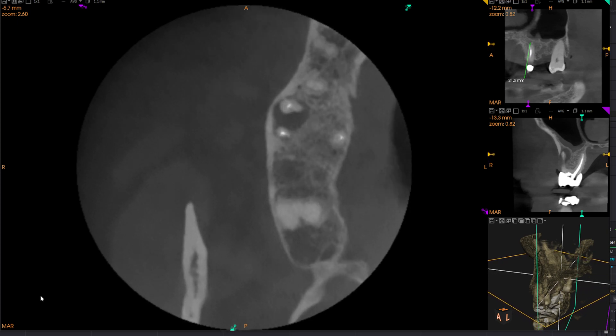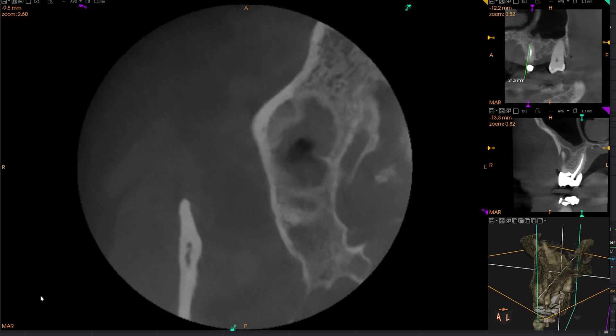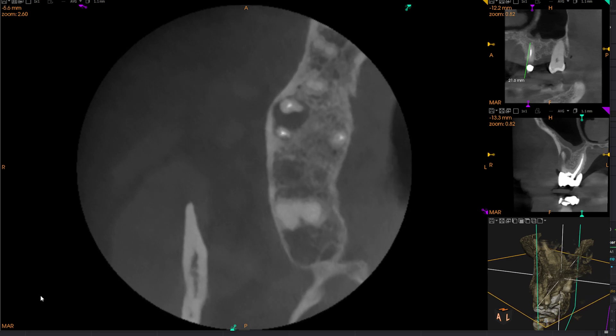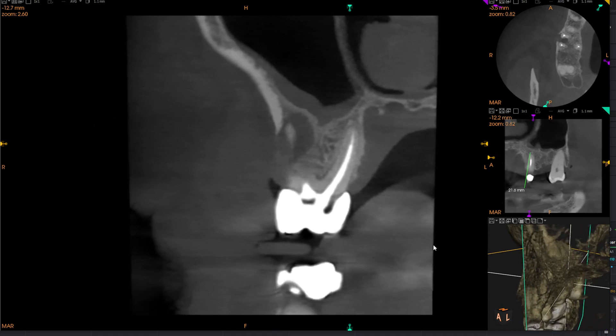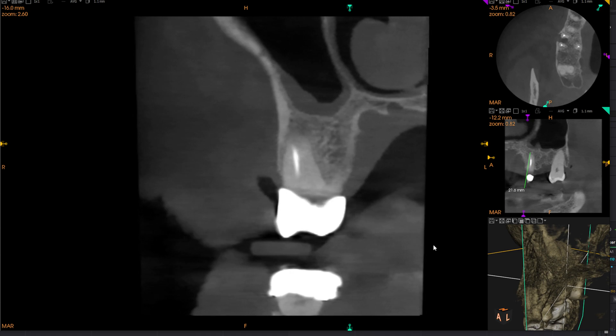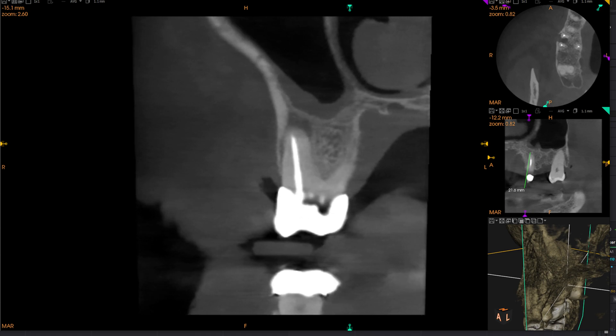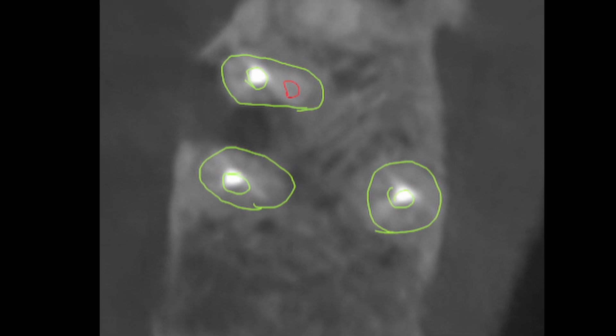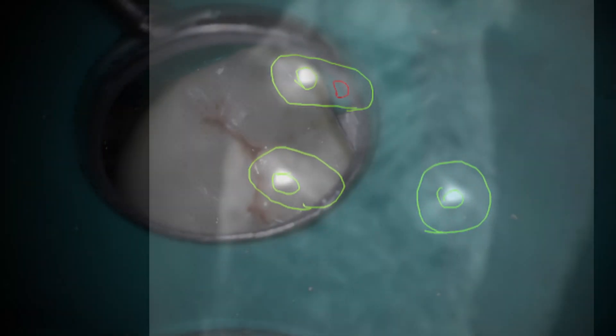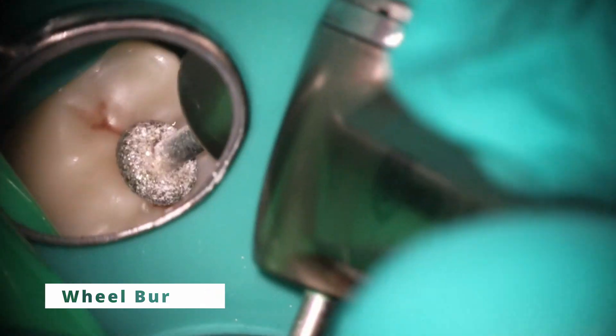Here's what it looks like on the scan. You can see it's involving both of those buccal roots. However, when we look up and down the scan, the palatal root actually looks very clean. So what I'm going to do here is a staged retreatment — I'm only going to address the buccal canals, and you can see my drawing of the missed MB2 that's causing it. I'm going to leave the palatal alone.